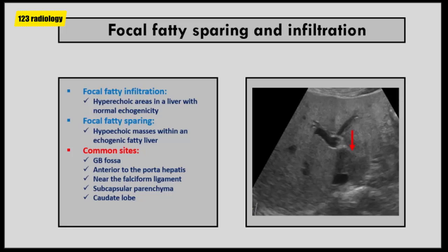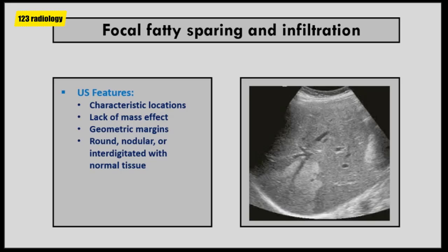Focal fatty changes may mimic a focal neoplastic lesion; however, ultrasound characteristics of the focal fatty pattern may differentiate the two entities. Focal fatty changes have characteristic locations, lack of mass effect, and hepatic vessels are not displaced. They also have geographic margins, but may appear round or interdigitating with normal tissue. As you can see in this case, there is an area of focal fatty infiltration in the right hepatic lobe, seen in the subcapsular parenchyma showing geographic margins, with a hepatic vein passing through it with no mass effect.